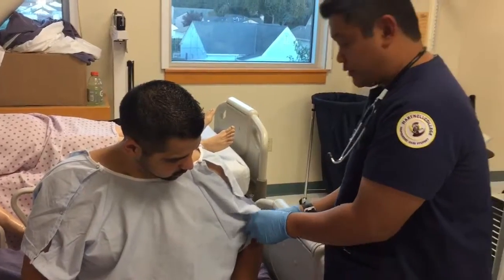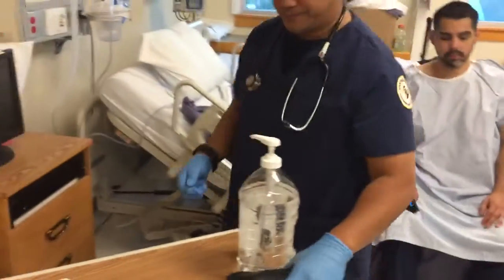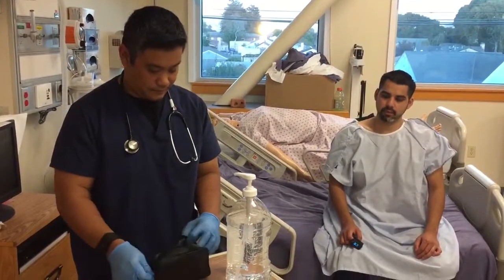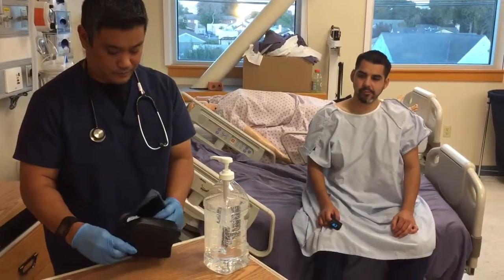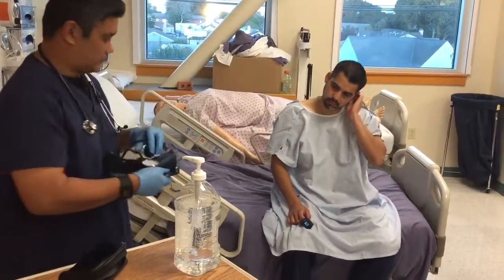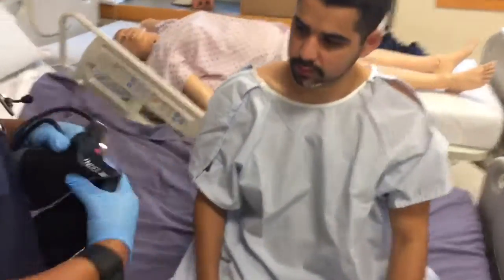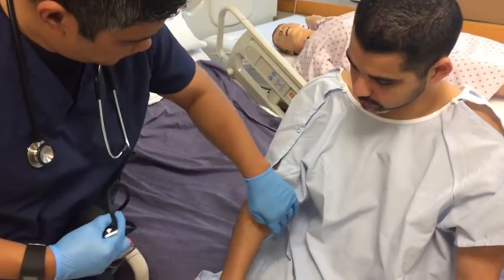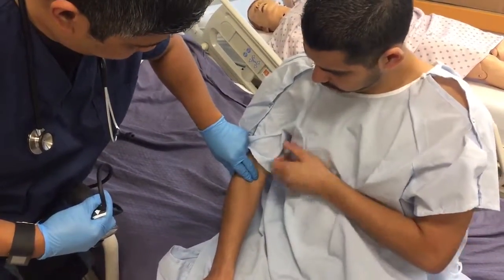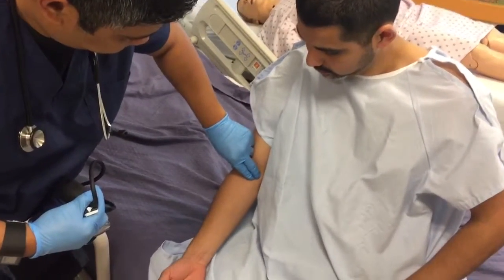All right, so we're going to be doing a blood pressure as well. I'm just going to check your brachial pulse. Did you expectorate anything?